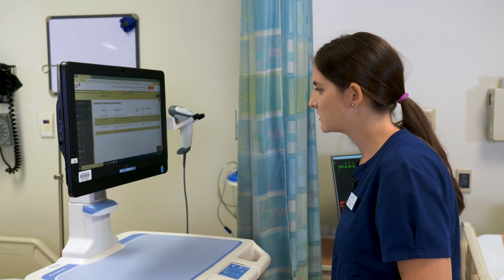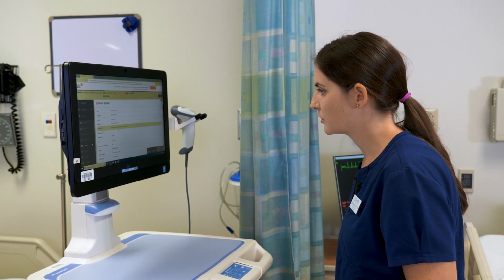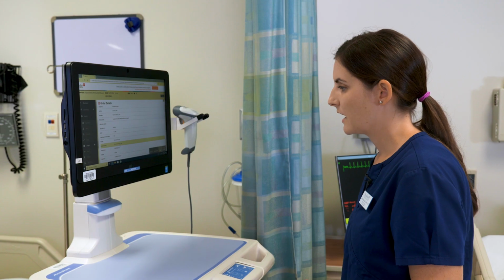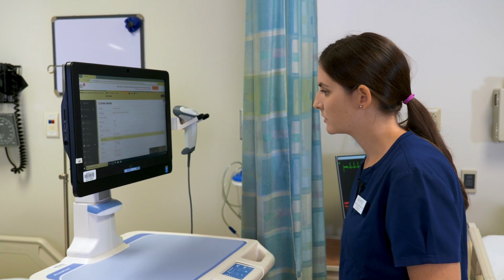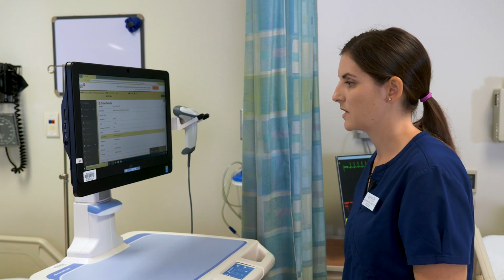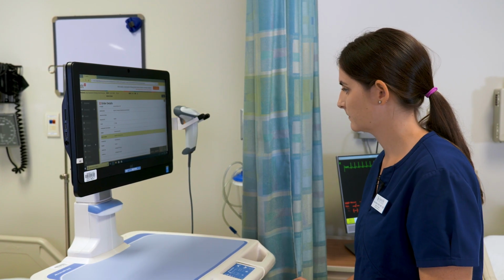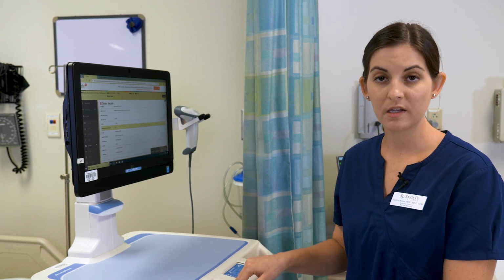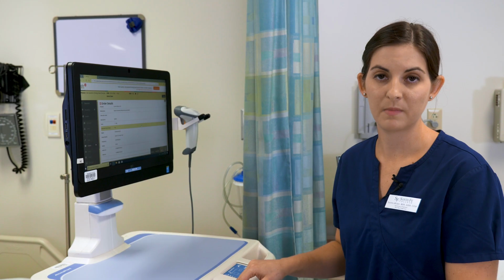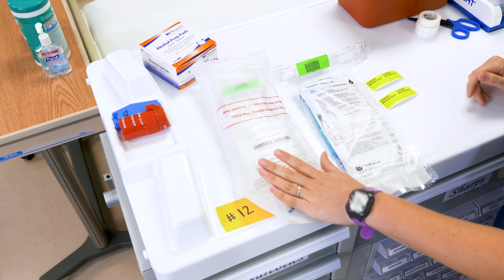I can see here that we have some normal saline that is due for maintenance IV fluid, and I want to know my rate of administration. My order detail says that it is going to be at 75 mL per hour. Okay. So now I'm going to go ahead and get my medication or my fluid out of the medication cart. I have my solution that I'm going to be administering.